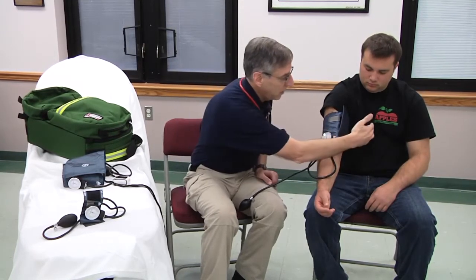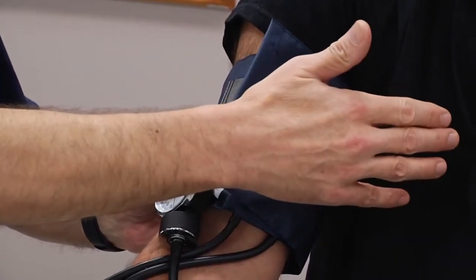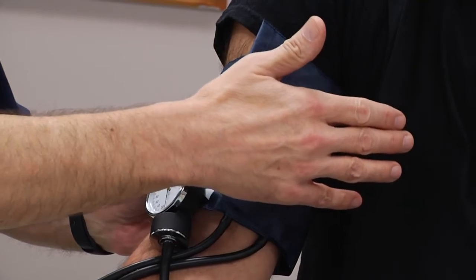Where the arm is positioned while you're taking the blood pressure is the second potential cause of error in blood pressure measurement. The extremity that you're measuring the pressure in needs to be at mid-heart level — this cuff needs to be right at the position of the middle of the patient's heart.